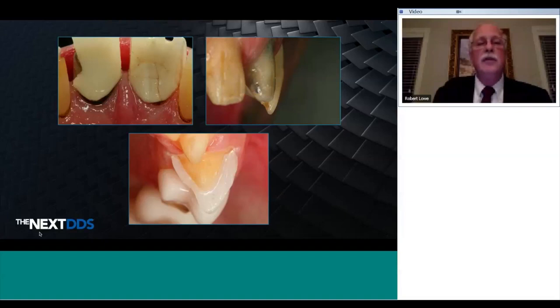Replacement restorations have provided most dentists with a lot of work over the years. And that's because, at least in this situation, you can see inadequate preparation leading to inadequate thickness of restorative material and fractures under occlusal stress over time. We're not doing the patient any favors by conserving tooth structure if we don't allow for proper thickness of material for strength. There just isn't enough space here for metal and ceramic to provide both of those for this tooth. So how conservative is it when we have to keep cutting things off and redoing? We want to have a uniform thickness and replace the natural anatomy of the tooth, yet still have a preparation that is protective in function.